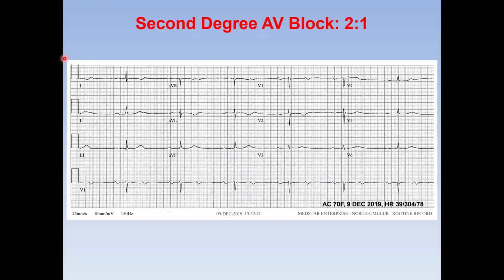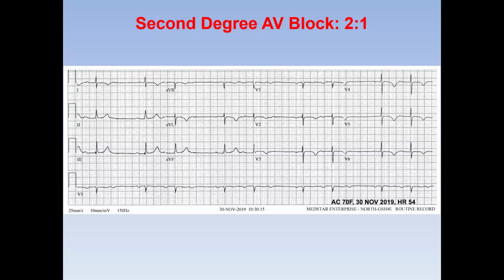I mean, it is 2:1 AV block. Then if we go into the location of the block, I sometimes find the Mobitz terms very, very confusing. So Wenckebach AV block, second degree, 2:1 AV block, and then you go to the location of the site. So if somebody tells me 2:1 heart block, I'll be happy with that. We don't push for it. So is there any role of pharmacological intervention to assess whether it is type 1 or type 2 in 2:1, whether it goes more in favor of type 1 or more in favor of type 2, with some, let's say, pharmacological test?